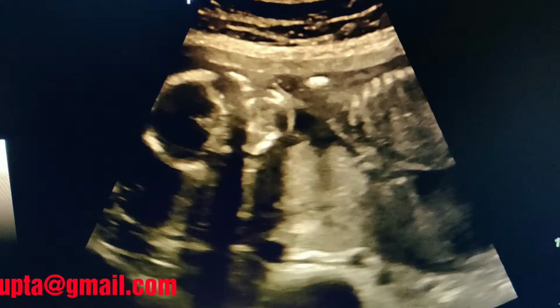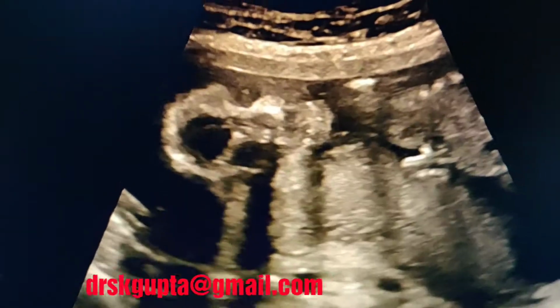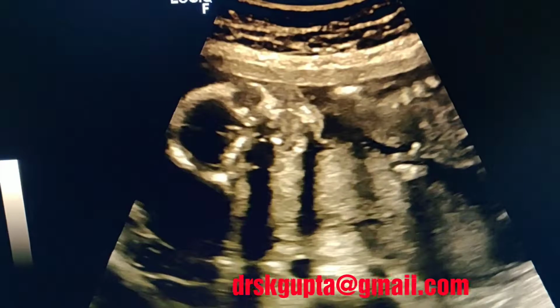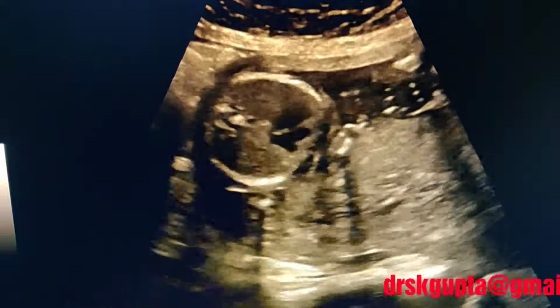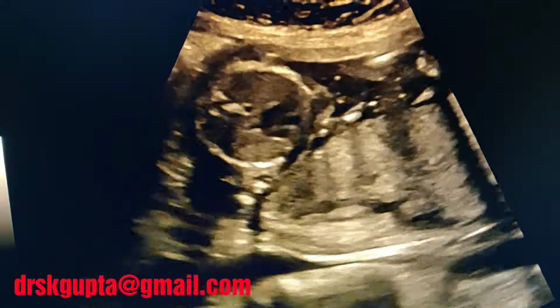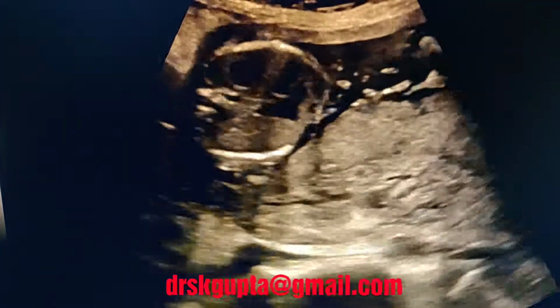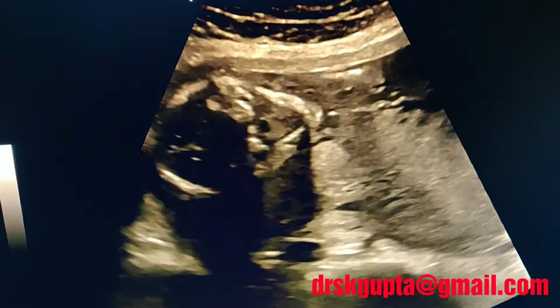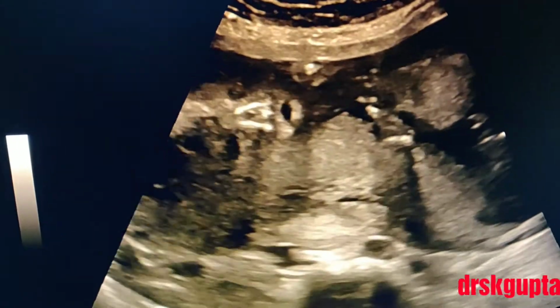and this is the face of the baby. Now this is the coronal section of the baby's face. When you take a section of the abdomen, the rib should be seen on both the sides, preferably one rib, to rule out that it is an oblique section. And you see the heart and the stomach is on the same side, making the situs solitus. You see the baby opening the mouth, and this rules out the cleft lip and the upper lip.